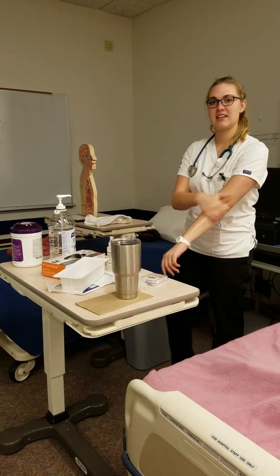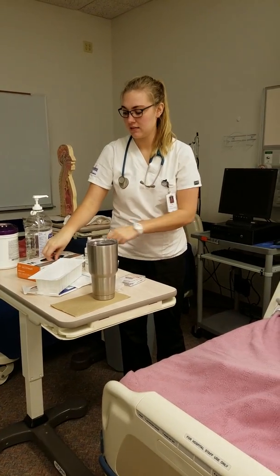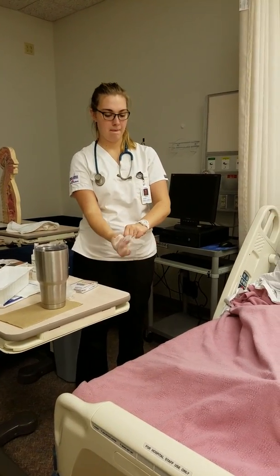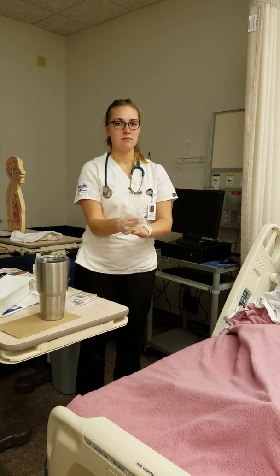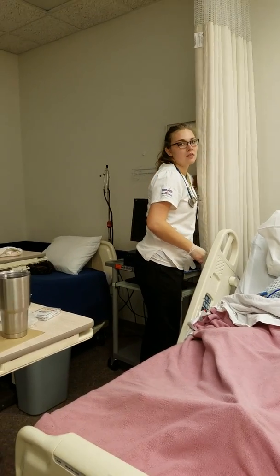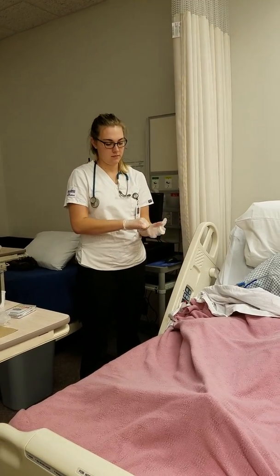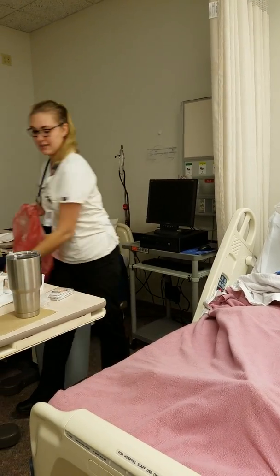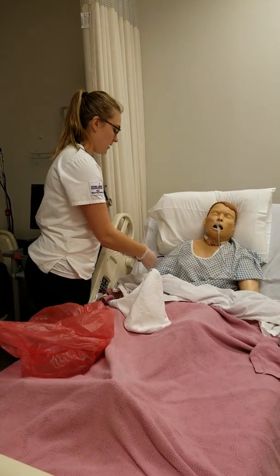We have a lot of hand hygiene. Gloves. And I'm going to turn off my suctioning. Okay. I'm going to grab my biohazard bag. Towel. Go ahead and unhook the suction now, okay?